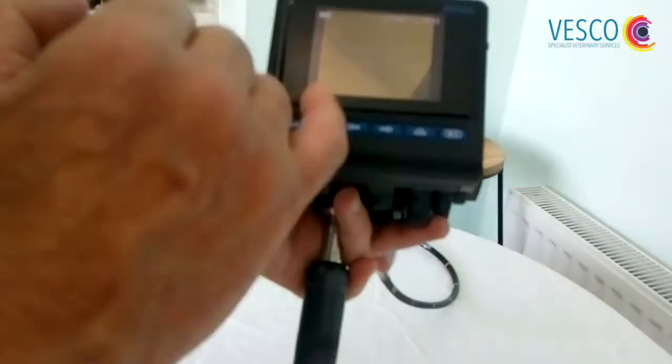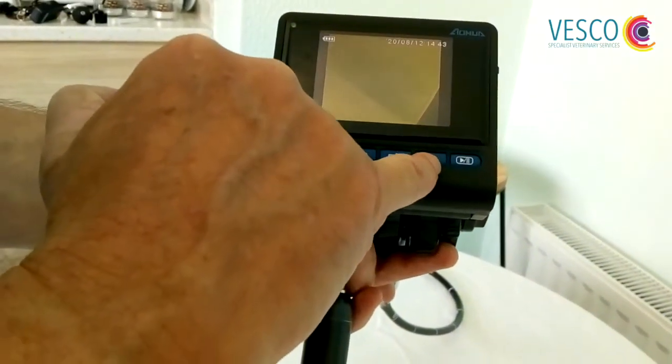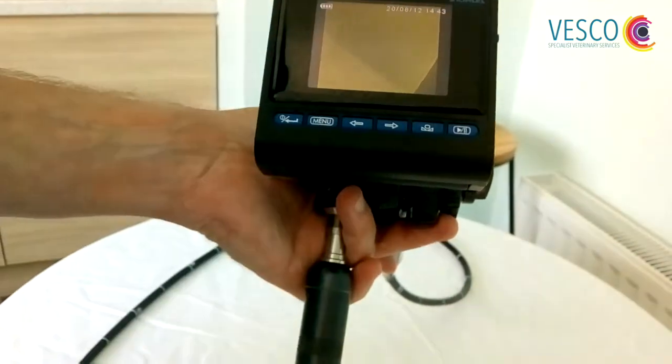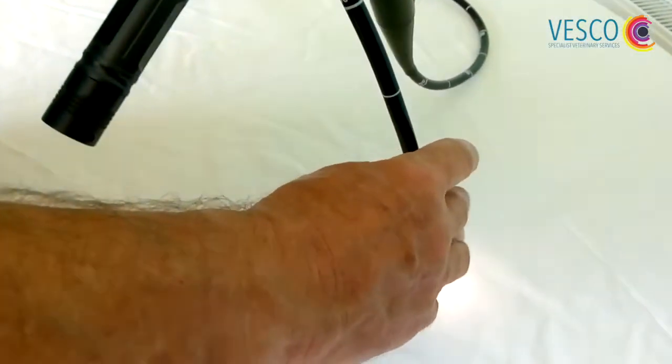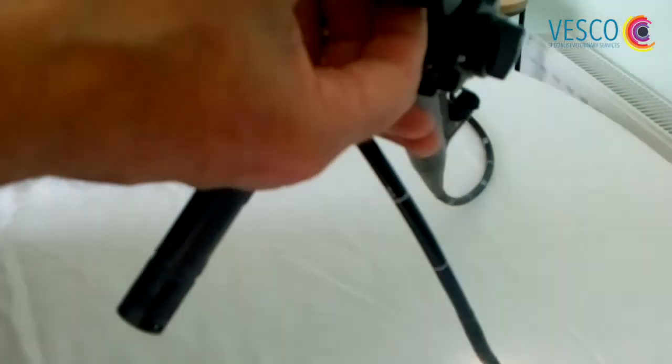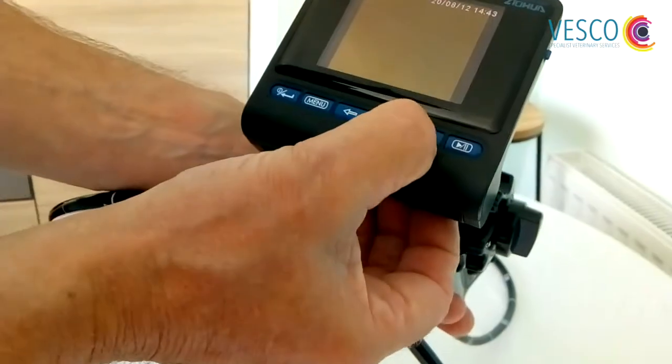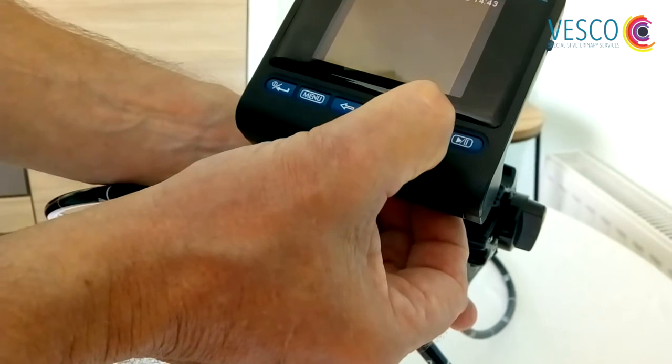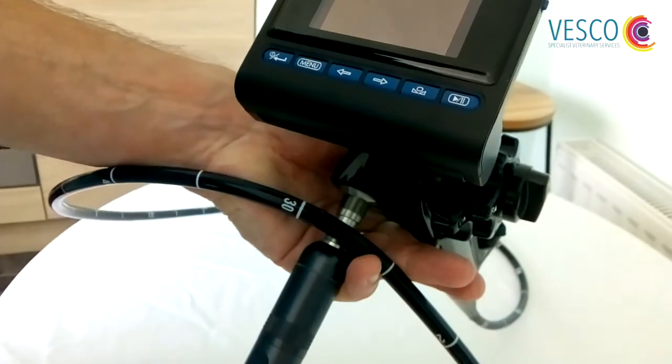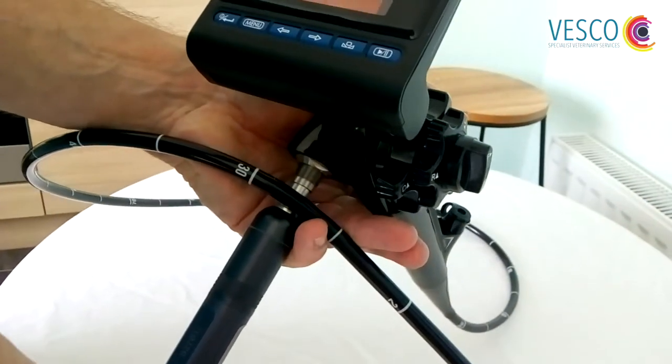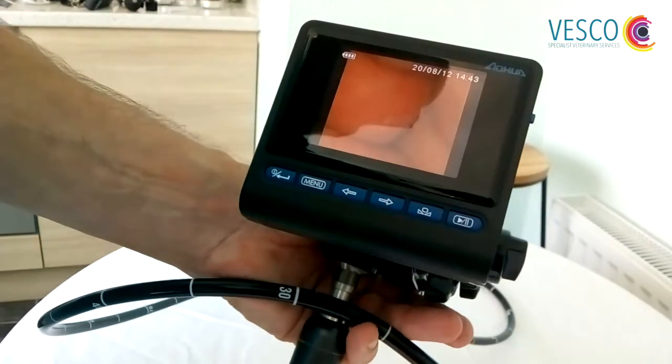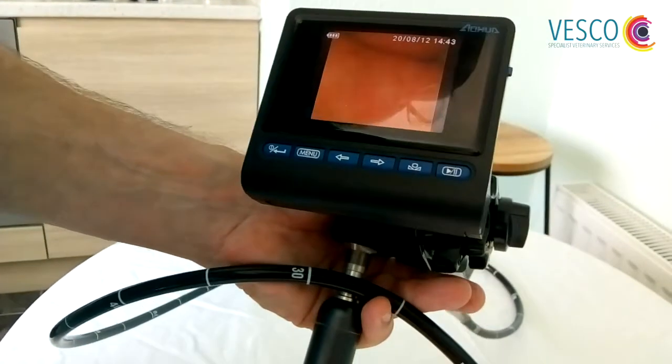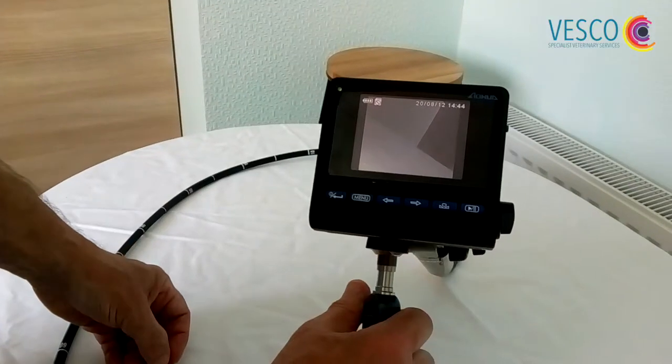We need to white balance it, so we have to tell the screen what color white is. To do that, we use this key here. Put the tip of the scope near something white, either a swab or something really white, and press and hold that button there. It goes to a gray color which is perfect, and then you can just cup your hand around or take an image, and that gives you the more natural color.